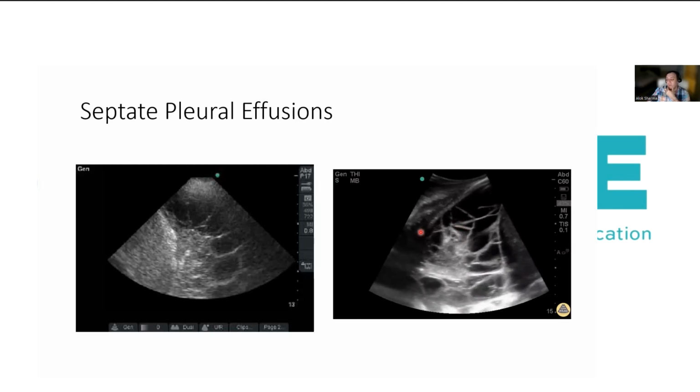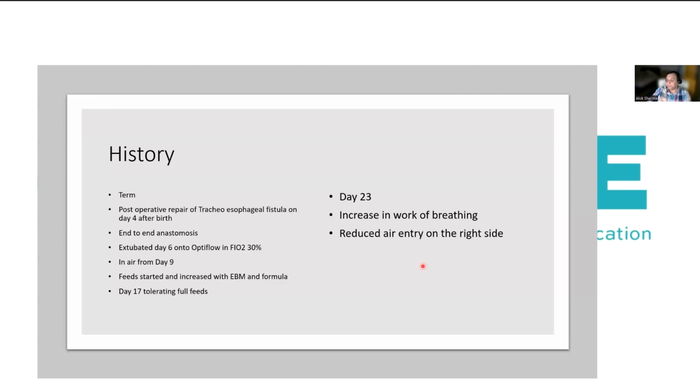We think we should get a large amount of fluid. And actually getting the radiologist to come in and tell us that it was the superior area of the lung which had the pocket and that our drain should go in there really was hugely beneficial in being able to diagnose and treat that baby.